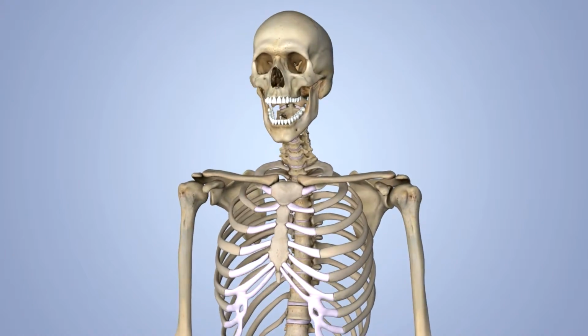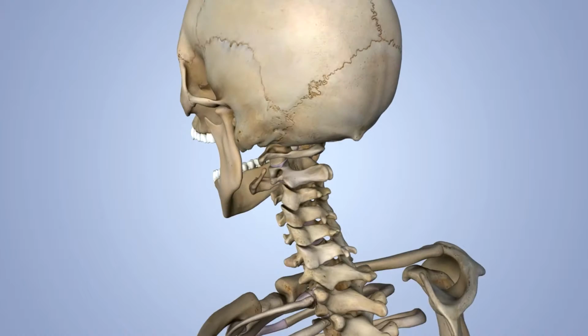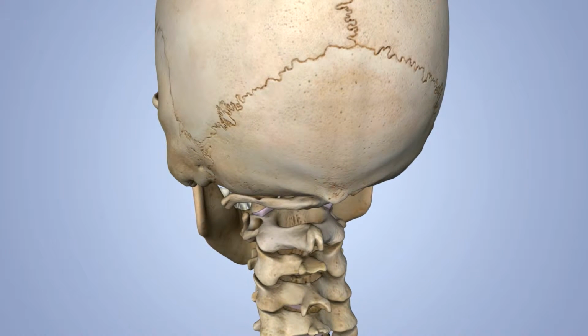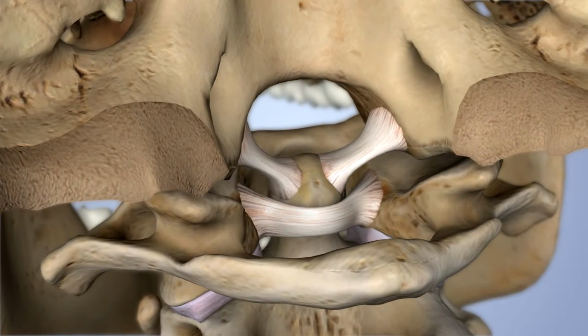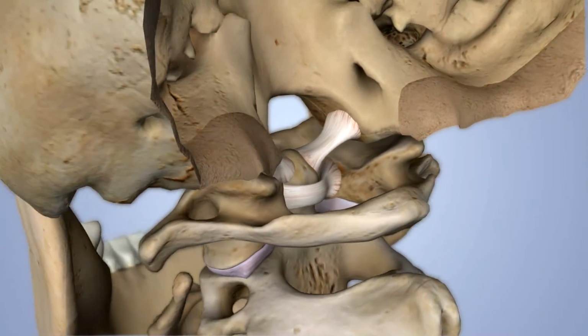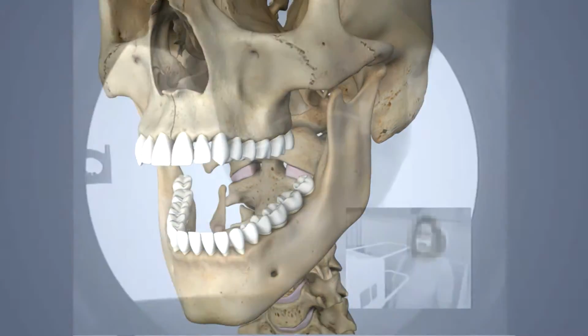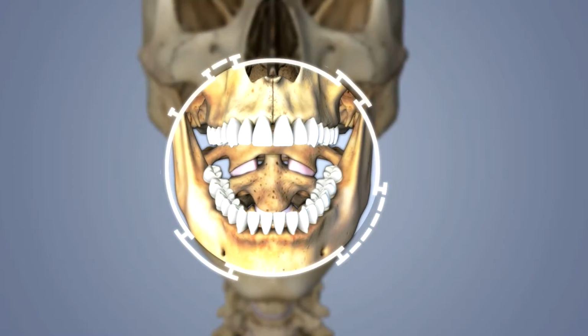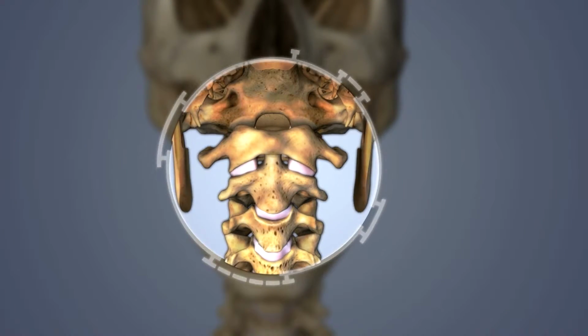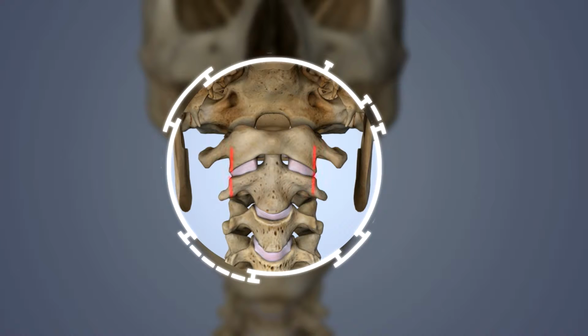In this motion x-ray, we're looking at two specific vertebrae, the top two. It's called C1 and C2, and the ligaments that hold them together and keep them lined up. And so we have these ligaments here, and then we're going to show a person with their mouth open in a motion x-ray, and these vertebrae are lined up side to side. In order to see those vertebrae, you have to have your mouth open, because otherwise your teeth would be in the way. So that's why this person has their mouth open.